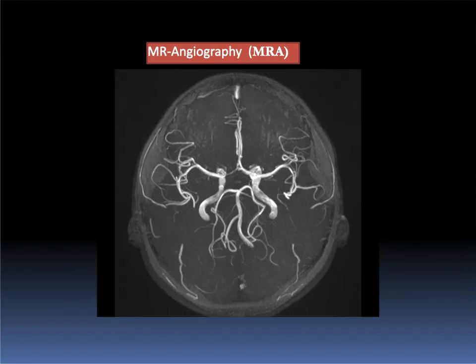We have MR angiography, MRA. We have two types, with contrast and without contrast. It depends on the sequence, time of flight or other details, but checking MRA with contrast.